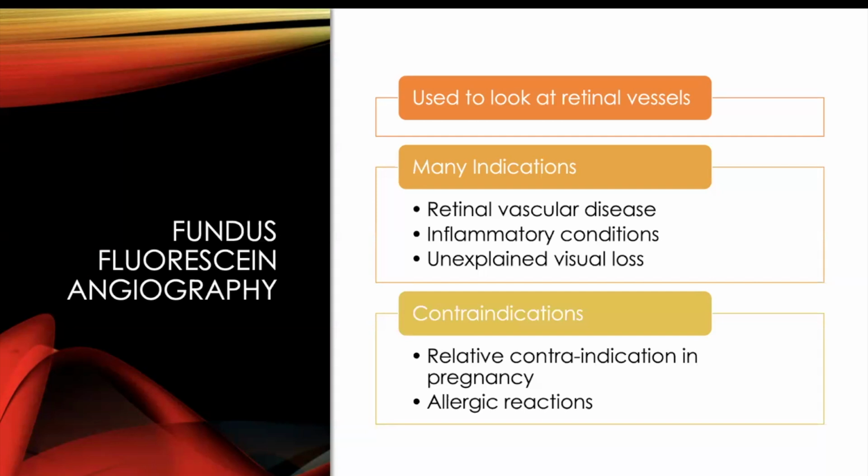So for those who are pregnant, patients who've had previous allergic reactions, and this whole thing about shellfish allergy is more relevant to ICG. It's not really relevant to FFA.